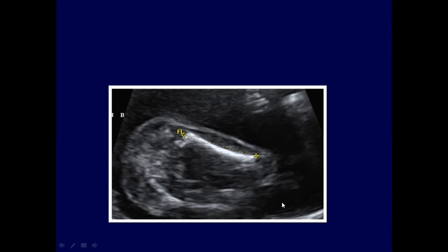This is the longitudinal section of the fetal femur. Longest section of the bone is obtained. Calipers are placed at the greater trochanter to the external condyle.